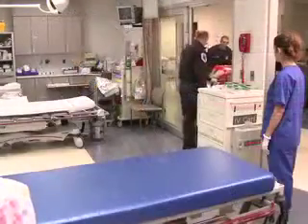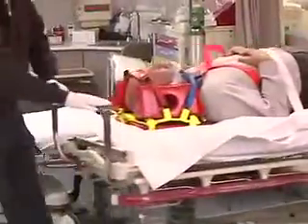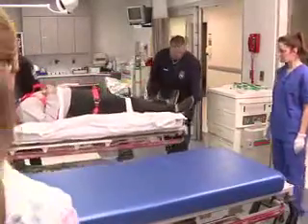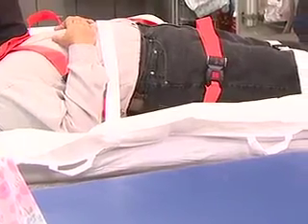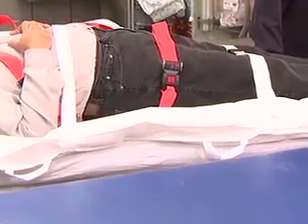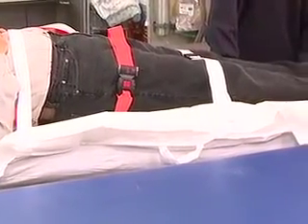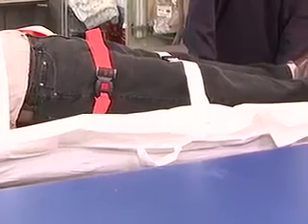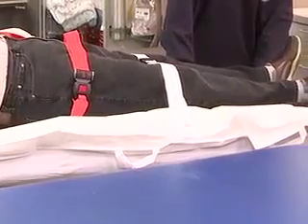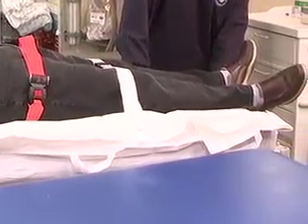When a patient presents to the ED, arriving by ambulance or otherwise, he or she should be transferred directly onto an ED stretcher that is equipped with a HoverMatt. Patients on backboards can go directly onto a HoverMatt-equipped stretcher. Ambulance stretchers may already be set with the reusable or single patient use HoverMatts. If this is the case, use the HoverMatt to transfer the patient from the ambulance stretcher to the ED stretcher.